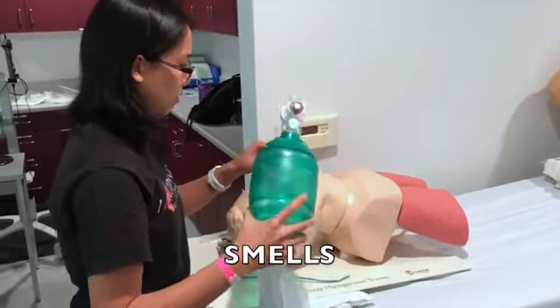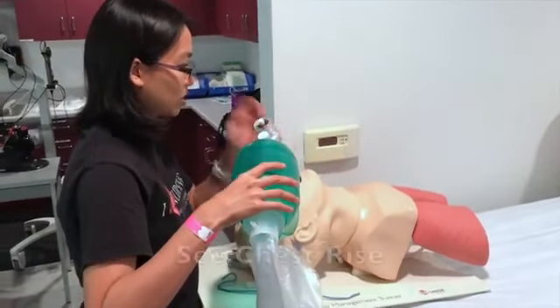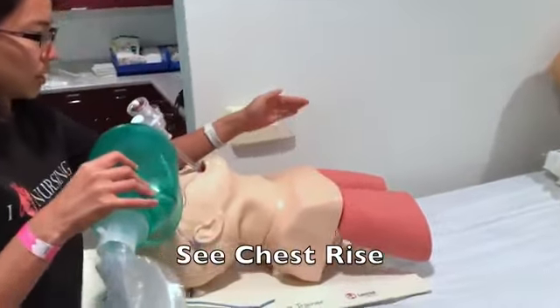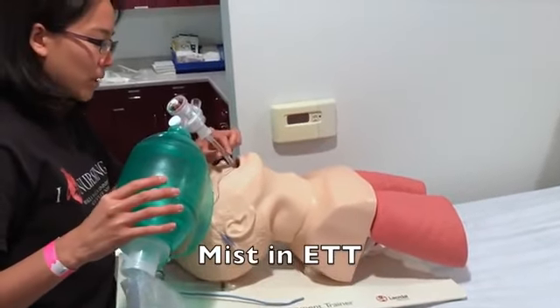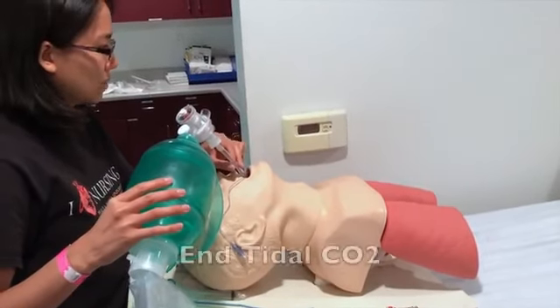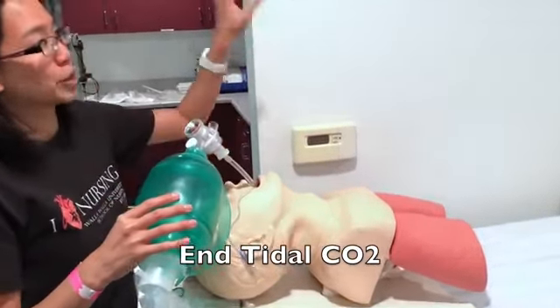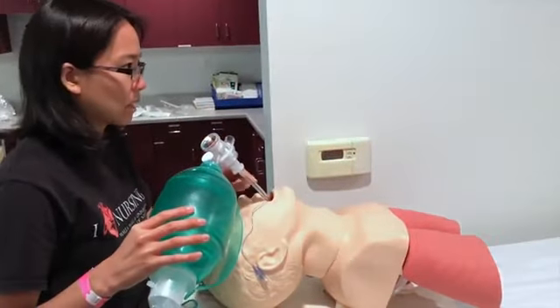Okay, so SMELLS. Basically, the first S stands for see chest rise. So as you inflate, you would see the chest rise. M stands for mist. When the patient exhales, there'll be mist in the ET tube. E stands for end-tidal CO2. So on the monitor, you'll be able to see waveform and appropriate numbers.